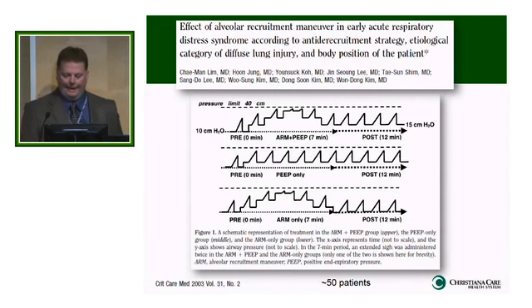Here's another one that did, again, another variation of this. They had alveolar recruitment maneuvers, and they looked at a couple different combinations. They basically, in the schematic here, looked at doing a recruitment maneuver, and at the end of the maneuver, it says they increased the PEEP. So they put the PEEP up after that maneuver, or they just turned the PEEP up to see what happened, or they just did the recruitment maneuver but kept the same PEEP after the fact, okay? And they did that in about 50 patients, spread through the different groups.